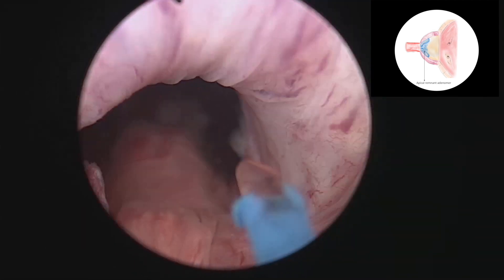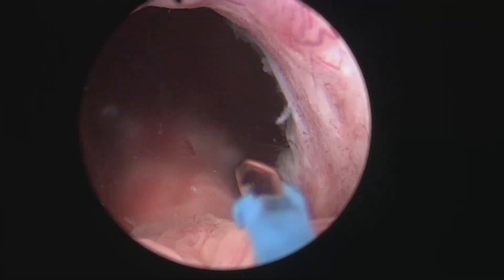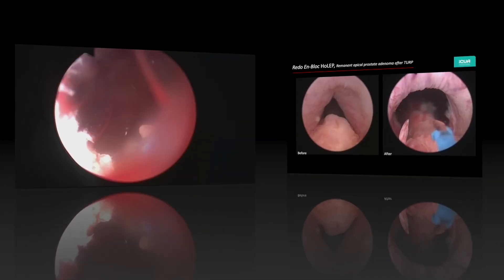The patient voided the next morning after four years of self-catheterization. He was extremely happy. You can see the excellent preservation of the sphincter.